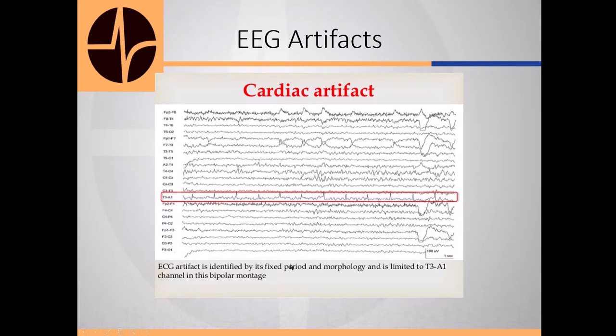So people ask me, well, I don't have enough channels to run that EKG in there as well. Then listen to the anesthesia card, and you can hear it. It goes beep, beep, beep with the heart rate, and you can document it that way.